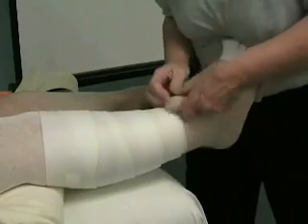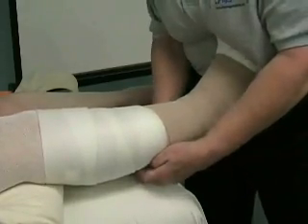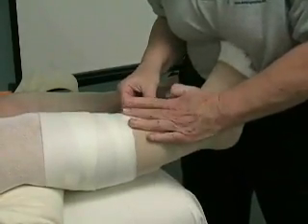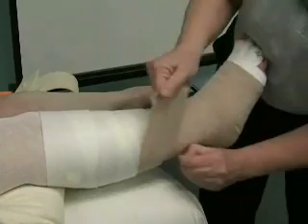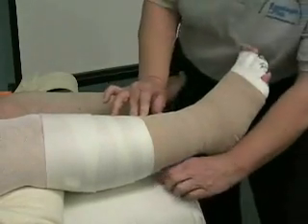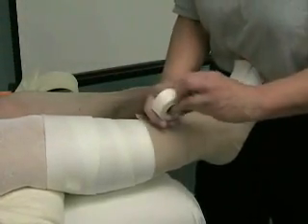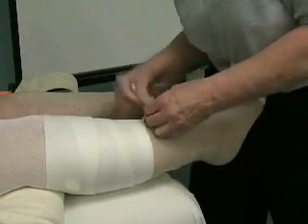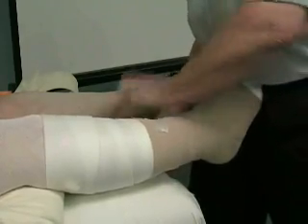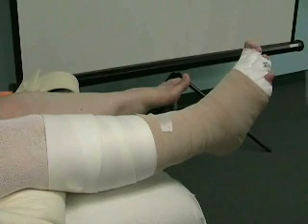Now I'm going to come around. This is why I like the double length bandage — this is not double, that's why I said I like it, because then I'm able to go up higher. Does all that short stretch come from the double length? Not all — only the 10 centimeter does, and the 12.